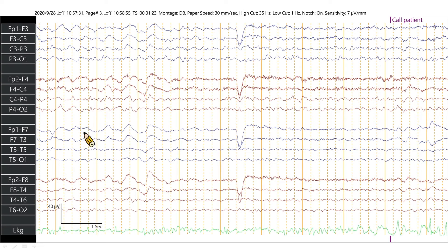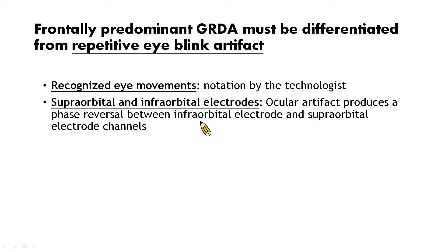FIRDA should be differentiated from eye-blinking artifacts. The contour of eye blink artifacts may be sharper, and the field is smaller than FIRDA. Most importantly, we can recognize eye movement by the notation of technologists and supraorbital and infraorbital electrodes, because ocular artifacts produce a phase reversal between infraorbital and supraorbital electrode channels.